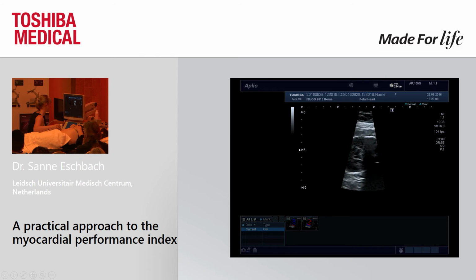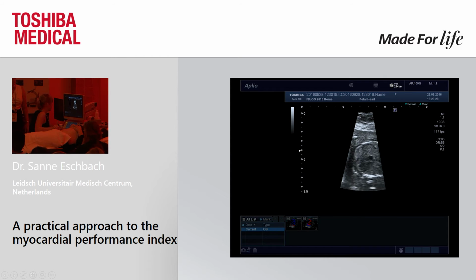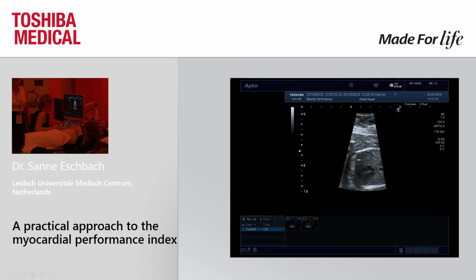Oblique, yes. The head is on the right side and the buttocks on the left side. So I'll try to obtain a four-chamber view as we know it. There it is. Then I'm going to make the plane as small as possible.